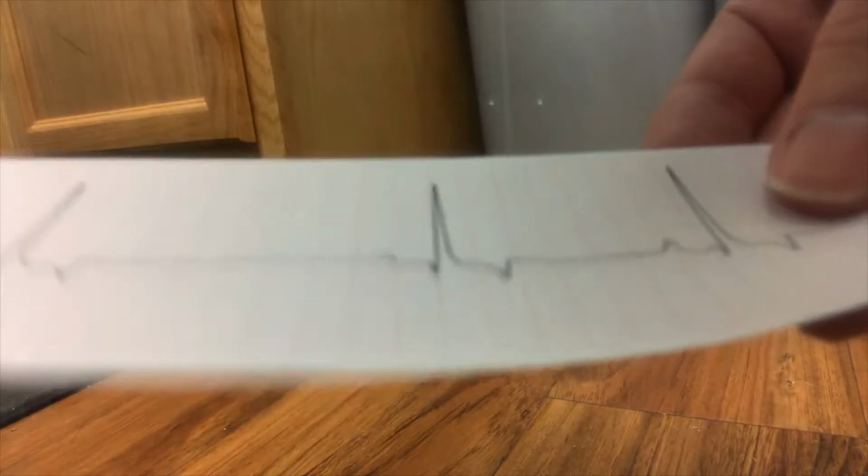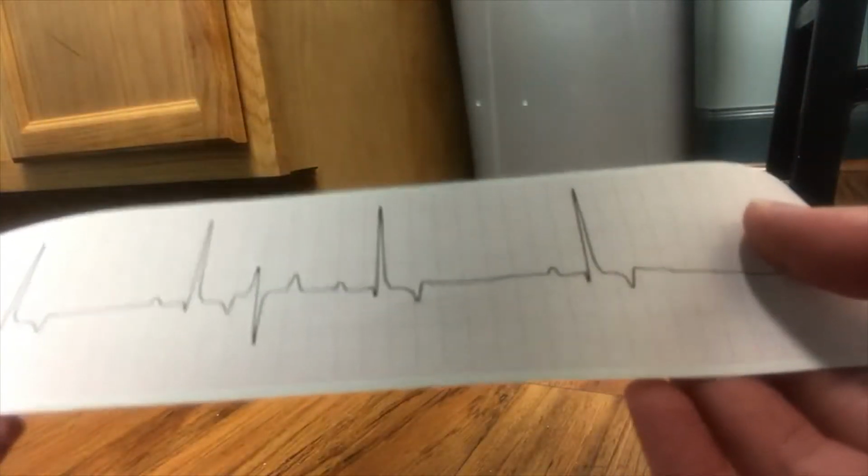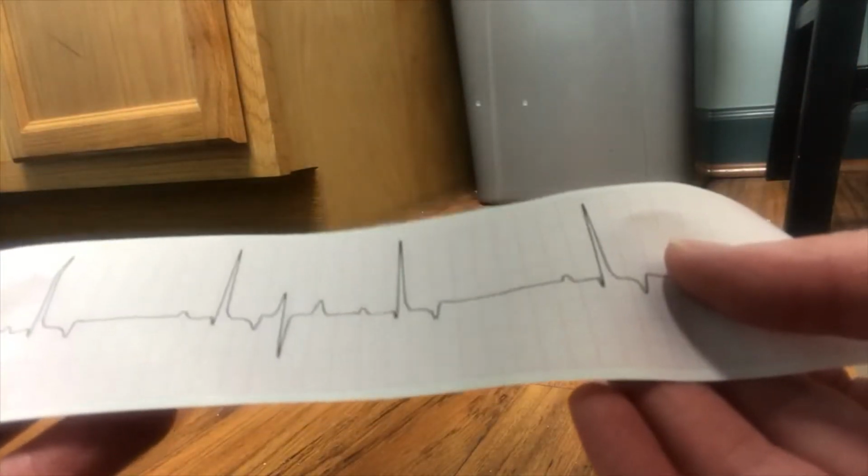There was one that I saw that made me kind of question, especially with this patient who has a history of VPCs. Where did it go? There it is. Passed by it. So on this one here, you can see, let me see if I can get this a little bit better here.